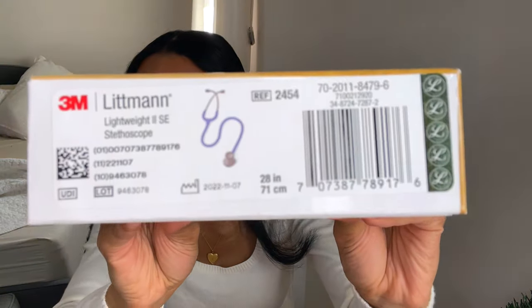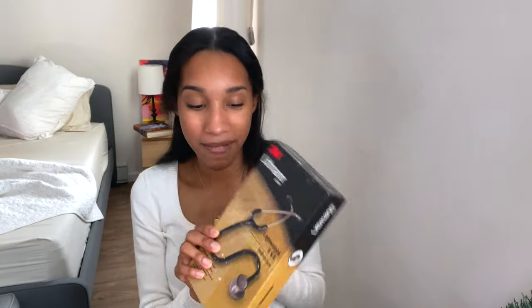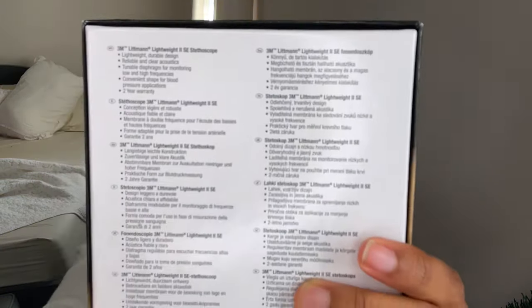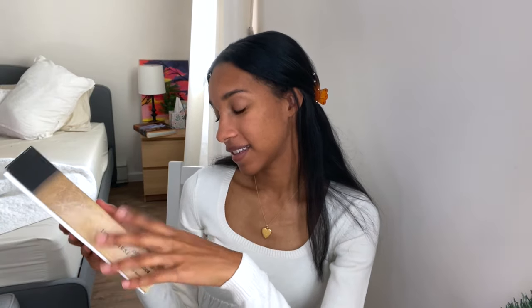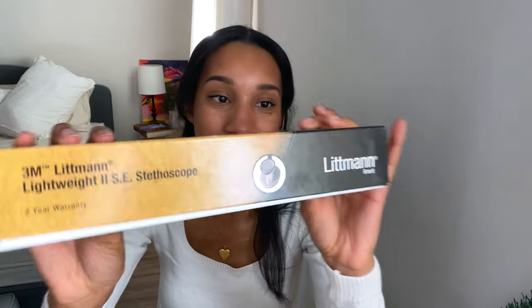He got me the seal blue color to match my scrubs, which is super thoughtful, and this is what the box looks like. It doesn't say the color on the box, which is interesting, but it's a seal blue color. It normally comes with a little plastic thing around the middle, but he snipped it off. So this is the Littmann Lightweight 2 SE stethoscope. The box lists: lightweight durable design, reliable and clear acoustics, a tunable diaphragm for monitoring low and high frequencies, convenient shape for blood pressure applications, and a two-year warranty.